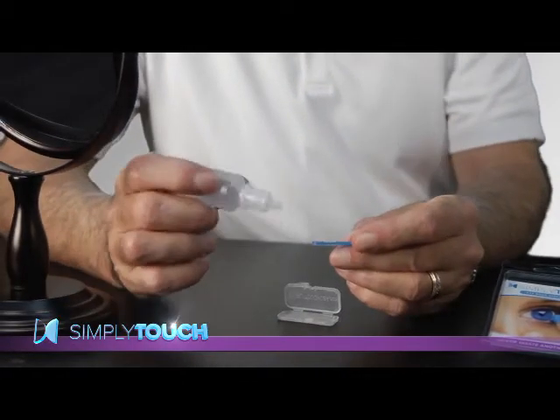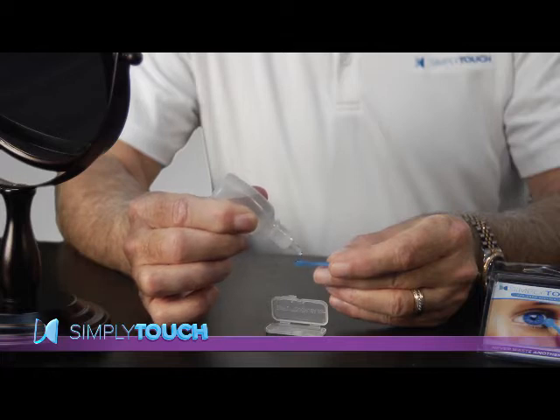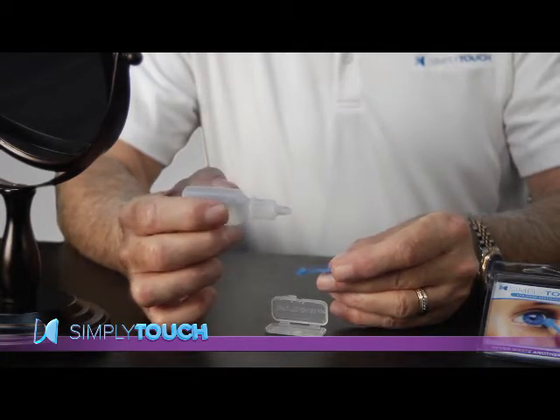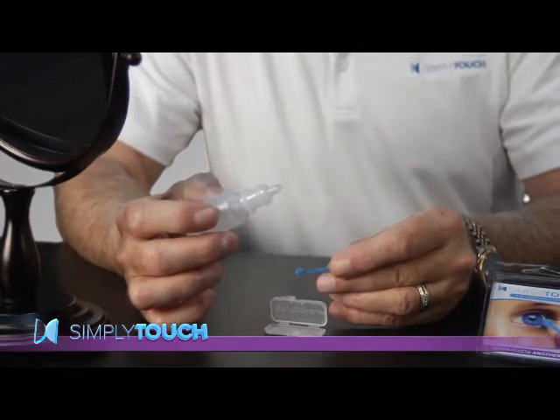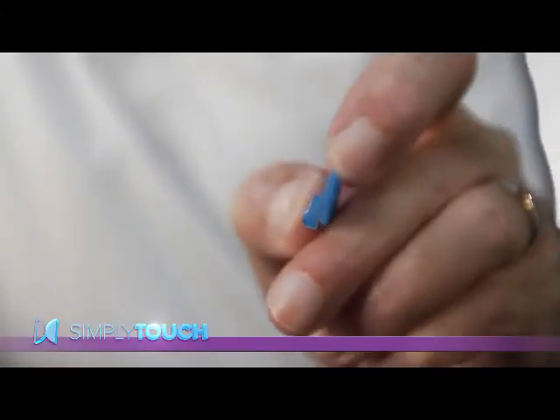You want to hold the applicator like this and the bottle at about a 45-degree angle. Now apply a small single drop on the round end of the applicator. Notice how the drop adheres to the surface no matter how I turn it, even with a certain amount of shape it stays on the applicator.